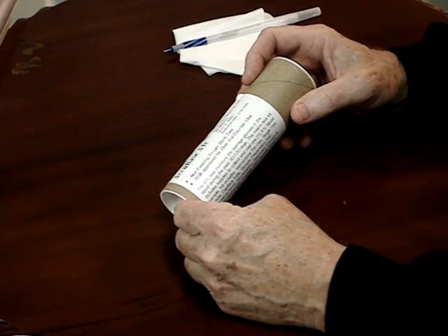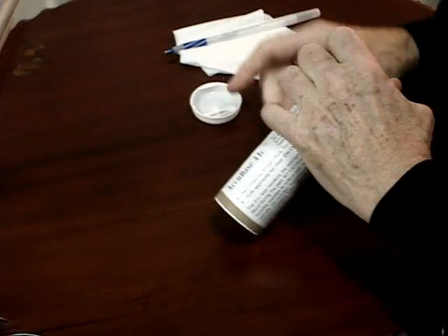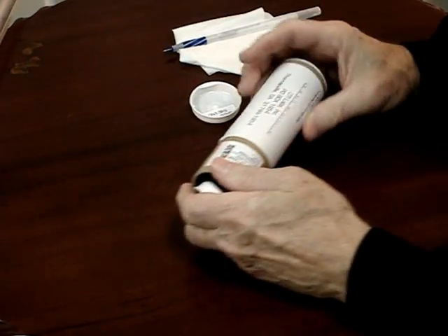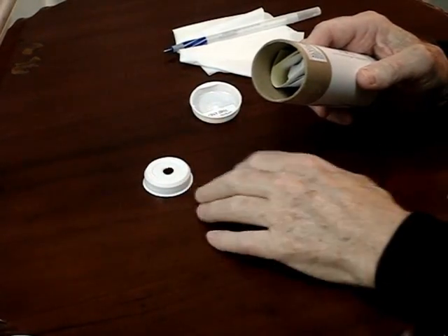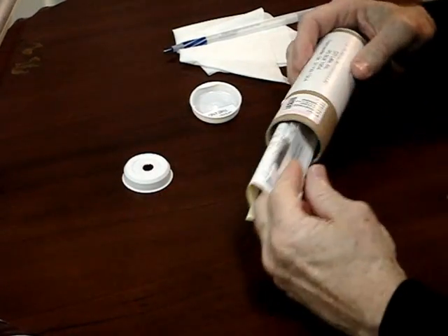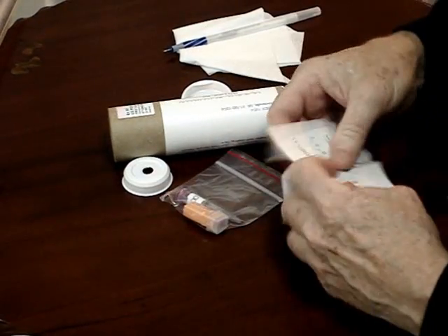First, open and become familiar with the components of this kit. Remove and set aside the tube mailer cap. You will need to replace this when you are ready to mail your sample. Next, locate and set aside the workstation used to hold your sample vial during sample collection. Now remove the remainder of the kit from the tube. Okay?